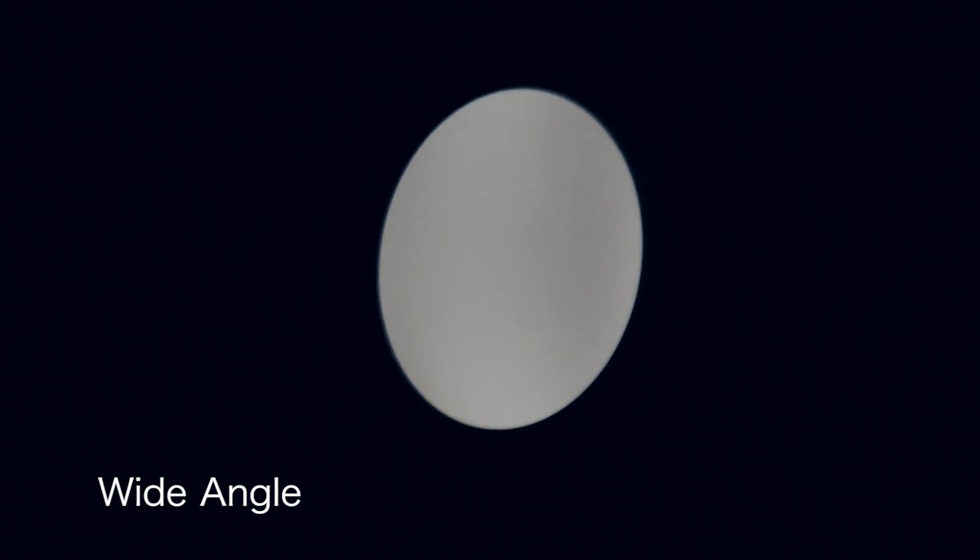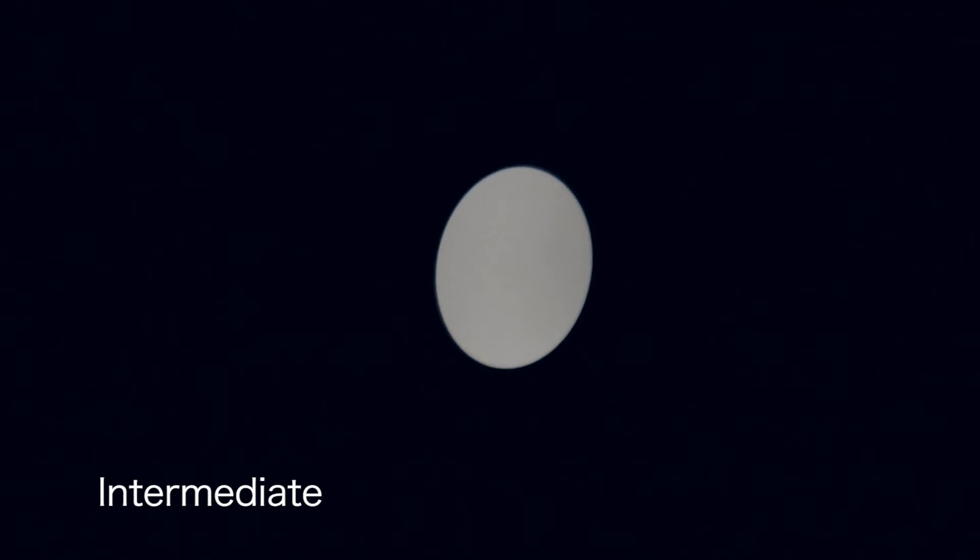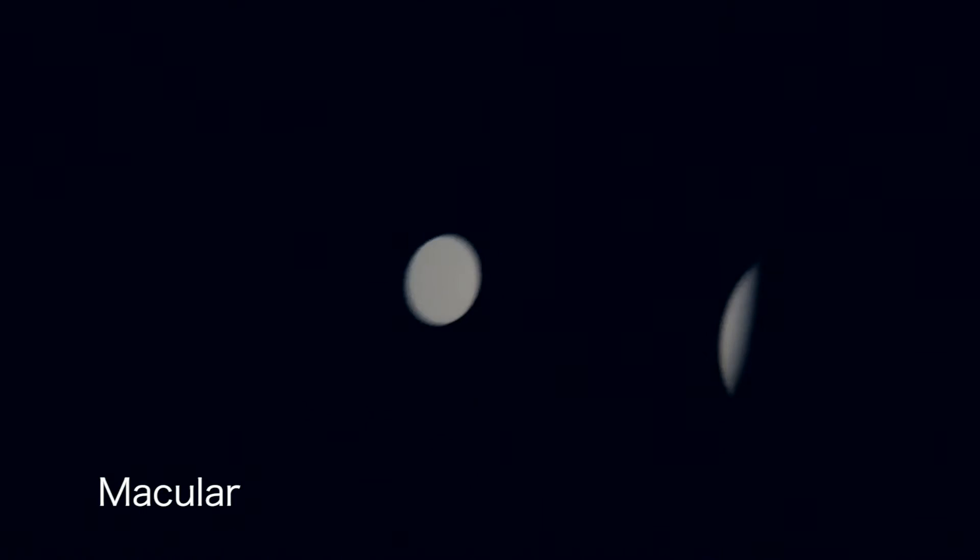The wide-angle beam illuminates the largest area and is best for general diagnosis through a dilated pupil. The intermediate beam is good for pediatric and peripheral examination. The macular beam reduces pupillary reaction and improves patient comfort. The slit beam is used to determine retinal elevations and depressions.